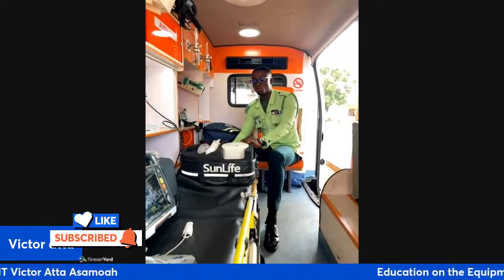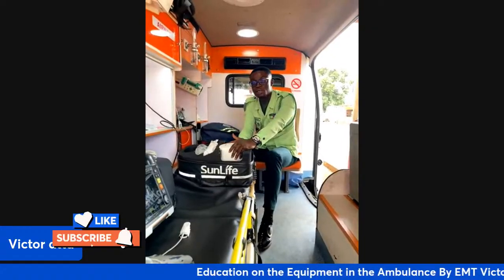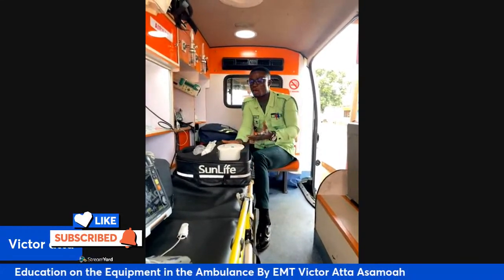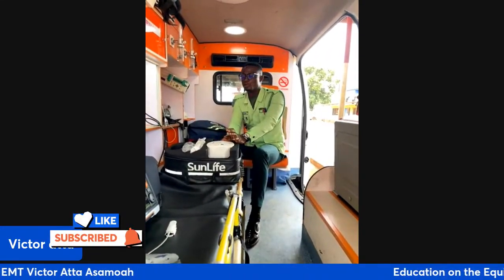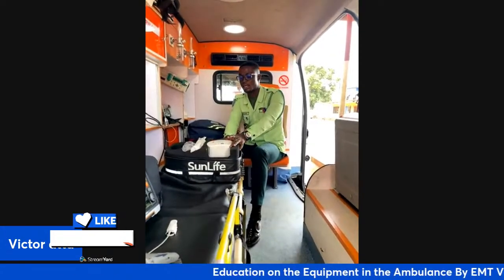It's used to do chest compression. So when you're doing CPR, at first, some EMS personnel will go to the scene. The patient will be unconscious. You will start chest compression using your energy, and sometimes you get exhausted.